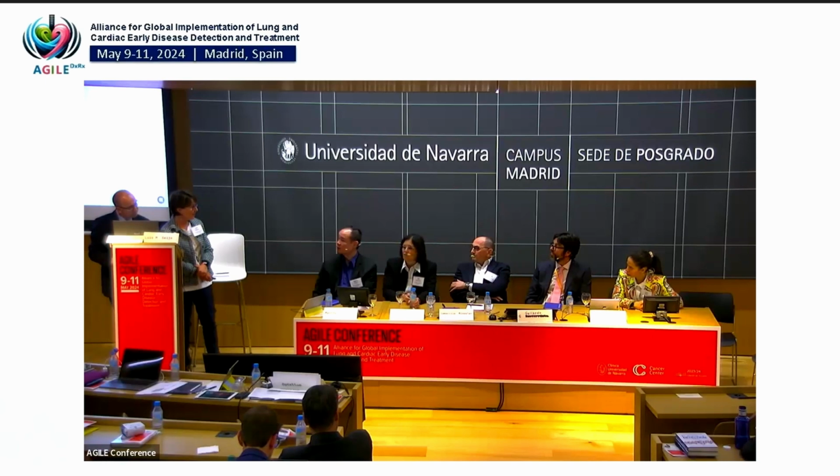Yeah, so Lung-RADS 0 should only be used in cases where you really can't examine the lungs or can't explain the abnormality. If they didn't include the whole lungs, that would be a callback to make sure you completed the part of the lungs that wasn't imaged. That's probably the clearest example. For infection, if you had a segmental or lobar pneumonia that you thought was infection, it would be a Lung-RADS 0 because you can't clear that part of the lung from having a lung cancer in it. So it would be treat for pneumonia and then bring the patient back for a 1 month CT.